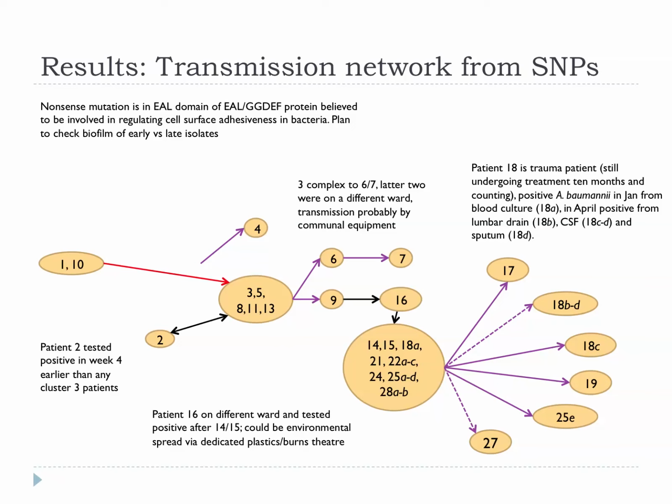Anyway, they're from different sites, and what we're learning, therefore, is that there actually is a heterogeneous population on the patient, which is not surprising when you think about it, but it's something that we're learning as we try and interpret this data, and we have to bear that in mind. Again, great minds think alike. Sharon Peacock has come up with the same story with Staph aureus, showing a patient with this MUT-S mutation who's accumulated various SNP variants within the same population on the patient.